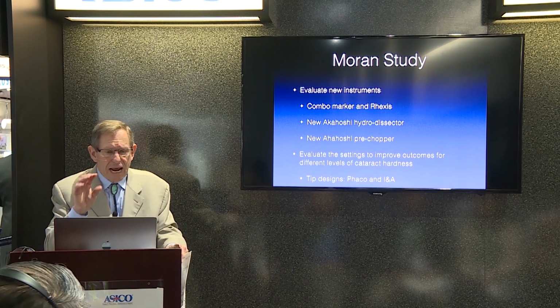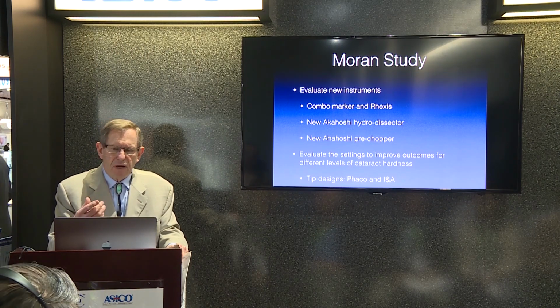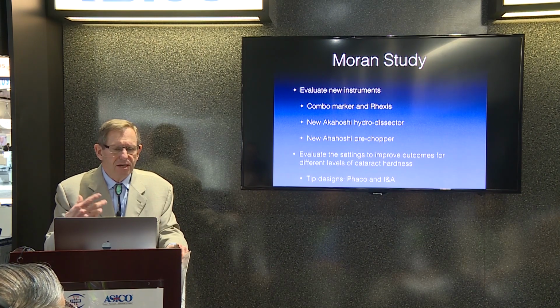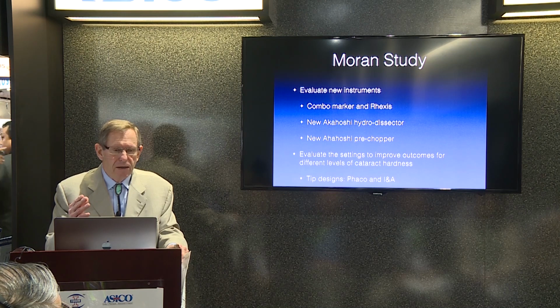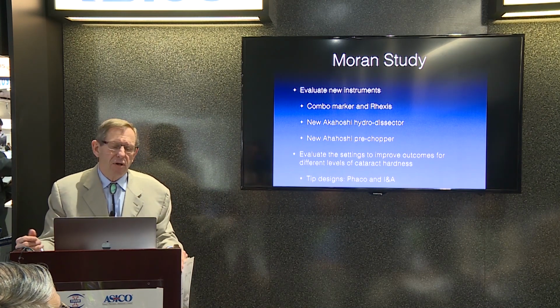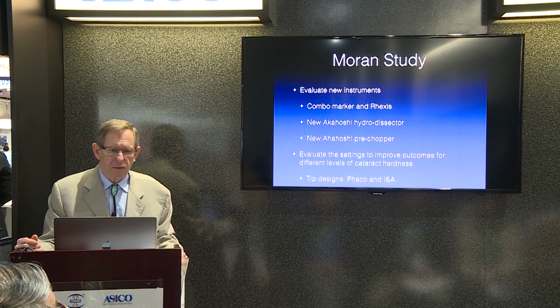So the taper, I think, is what makes it, and you don't need as much. You can use a 1 cc, 2.5 cc. Most people use a 5, it's okay, but you don't really need to do that because of the tapering aspect of it. And if you look at all the other, most of the cannulas are not that way.